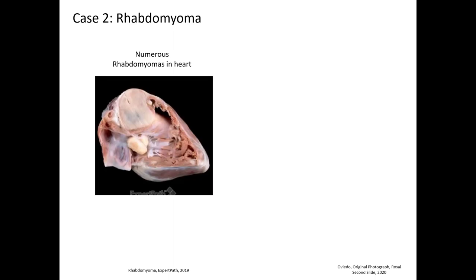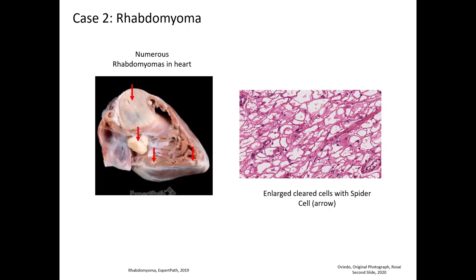Case 2 is rhabdomyoma. Here is the gross picture which has numerous rhabdomyomas — here is a very large one, here is another one, here is another one, and here is another small one. Here is the histology. You can see the rhabdomyoma is composed of these large cleared cells, and there is a spider cell right here in the middle.